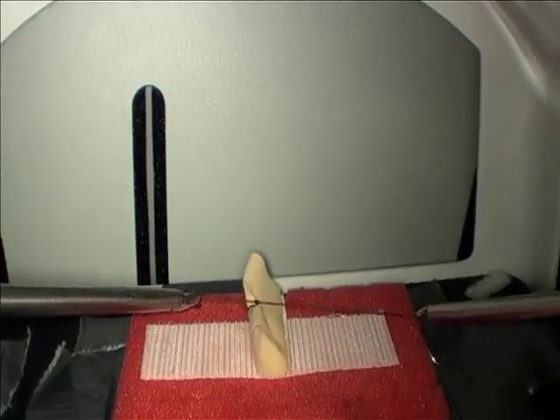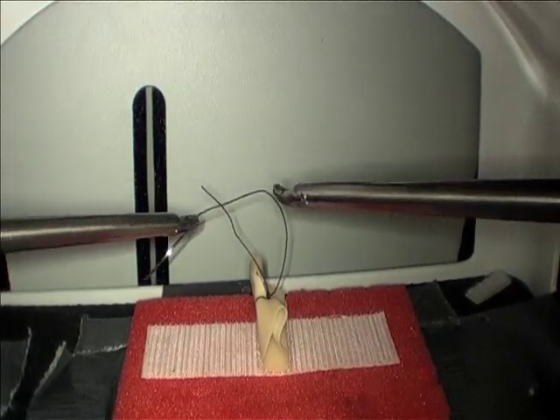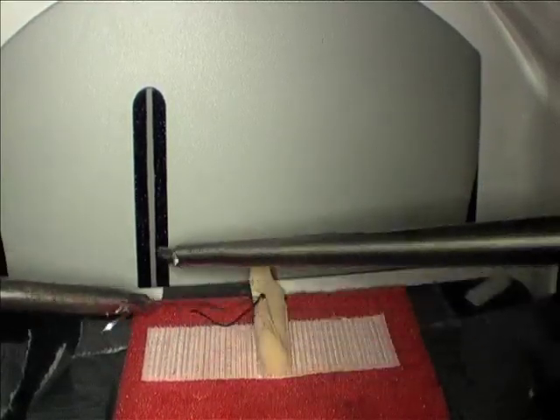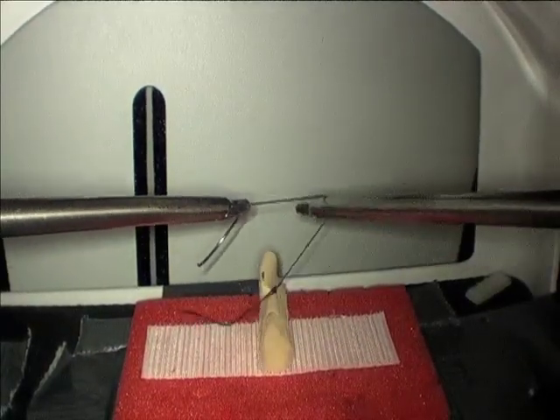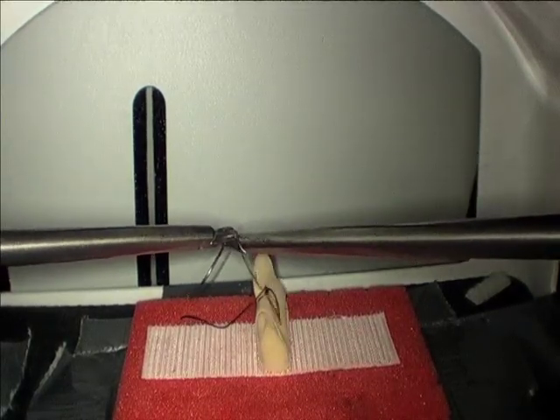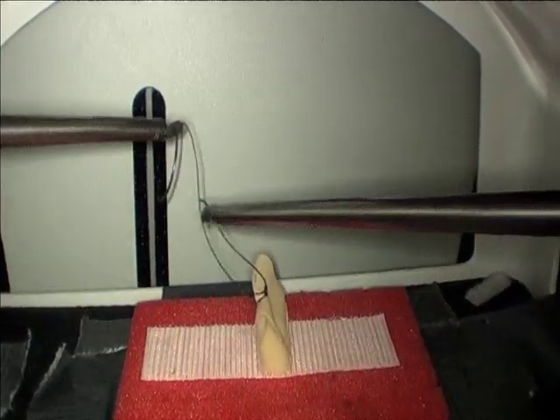Another common error is to grab the suture properly, but to work off to the left or the right instead of in the center. This makes it very difficult to set up a C loop. Your instrument should really not move very much left or right. The motion is more of a piston motion, in and out, directly over the center of your working space. This makes it much easier to make your C loop reach around and grasp your suture.